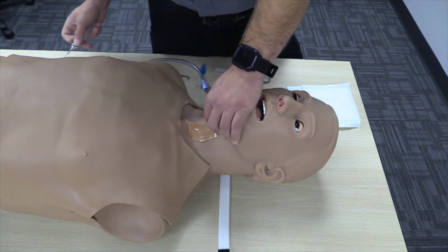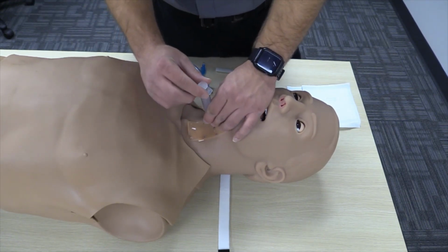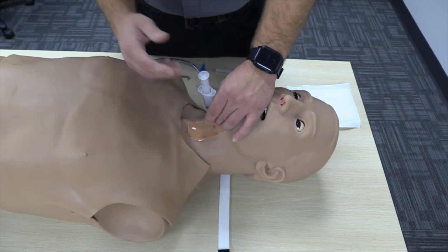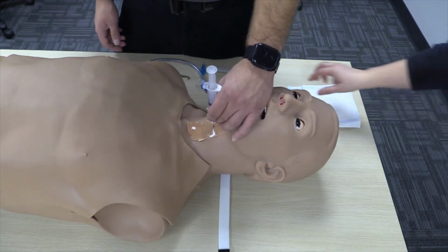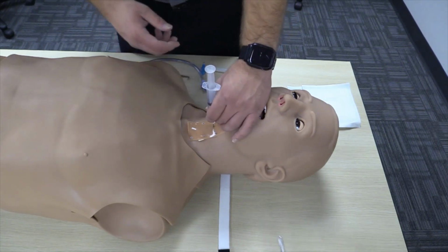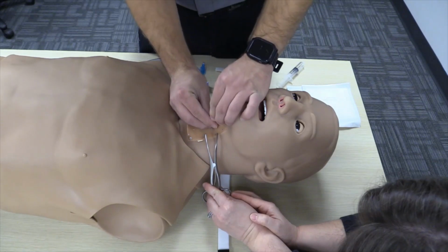So I'm going to take my needle that is already attached to my syringe and insert it in. As we insert it in, we should have rapid aspiration of the syringe. This is going to confirm that we're actually in the trachea. After you have that aspiration of air, we're going to stop and not advance it any further. Then we're going to remove our syringe and apply our forceps to it.